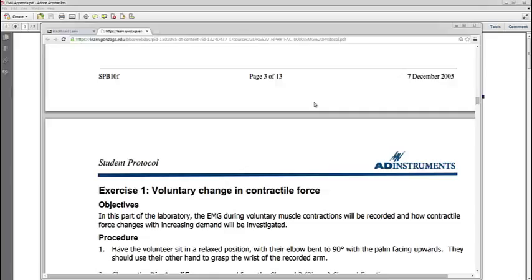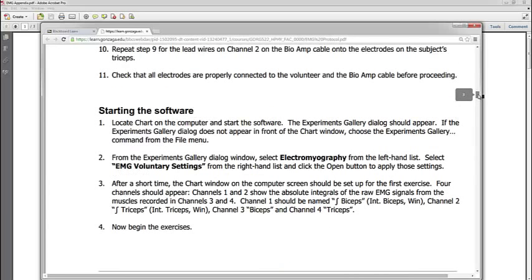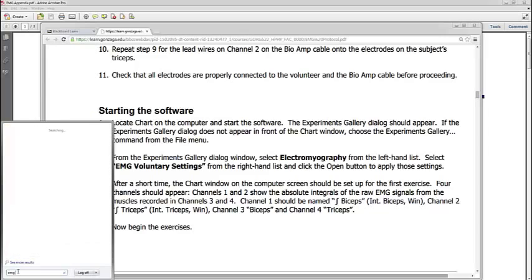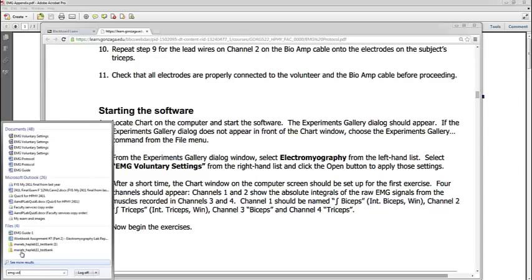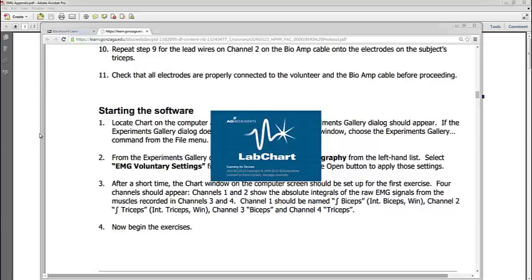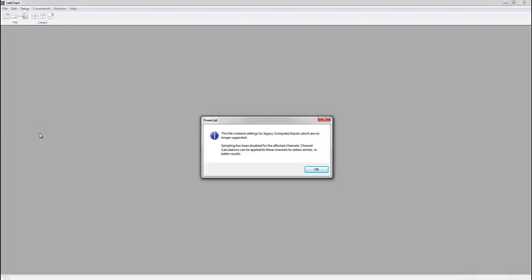For the first exercise, follow the instructions to connect your subject by connecting the electrodes to the biceps brachii and the triceps brachii in the arm. You'll also have attached the dry earth strap to the wrist. What I'm going to do again is just type in 'voluntary settings' in the search bar — EMG voluntary — and there, voluntary settings pops up. I'm going to click on that now that I have my subject hooked up, and click OK.